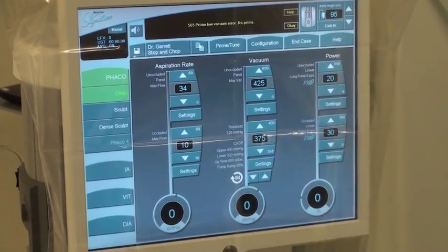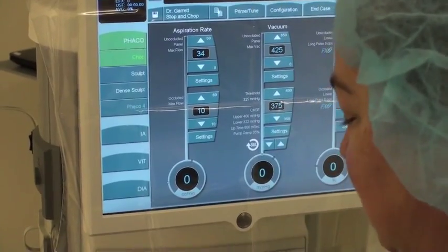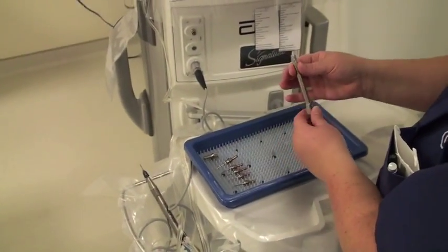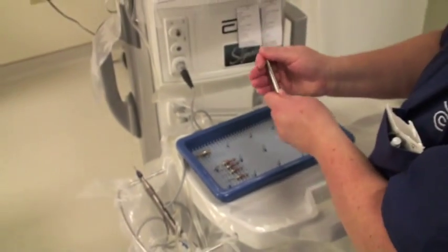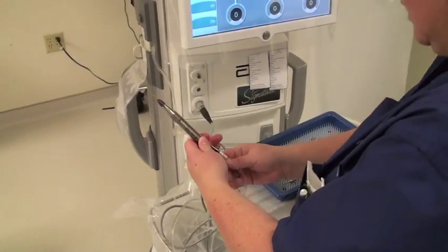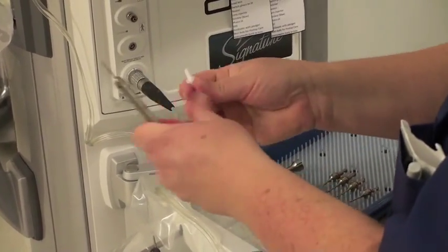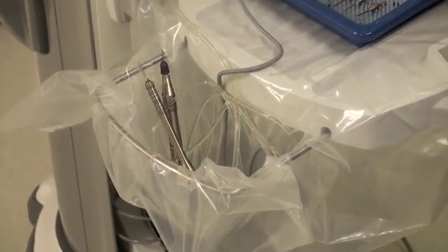Once it's completed, you'll go to your screen where all your systems are set. Then you just take your little sleeve off, empty out the water, and leave it in a little holder until you're ready to begin. The other part in the tray is your IA handpiece, and these are the various tips. Whichever tip the surgeon picks, you just place it in here. To hook this up to the phaco when the doctor is ready, he will take both pieces off and attach them here — or you can attach them, however they prefer. They just go right in there like you did with the handpiece, and then you just leave that there until the doctor is ready for the IA.